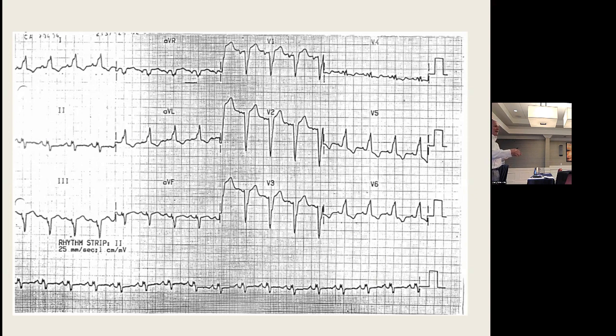All right. And also the cardiologists don't want to waste the time with a $200 test. No, I don't want to say that, and do a $1,000 test. But the reality is, cardiology needs to be present for a treadmill test, and it takes time. And they're not nearly as sensitive. Here we go. Not nearly as sensitive.